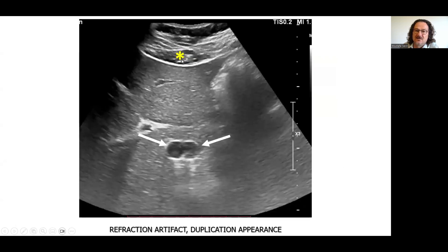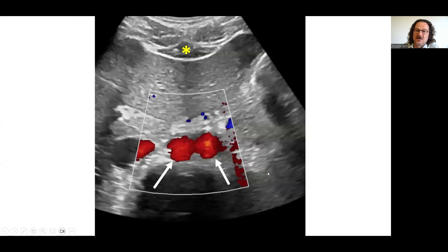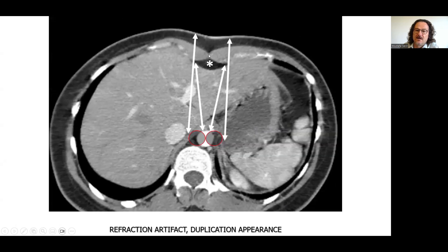Another consequence of the refraction artifact is duplication of vessels, due to this prismatic effect. The original sound waves travel normally, but the preperitoneal fat acts like a prism, refracting the sound wave so that the original aorta is seen as two aortas, incorrectly located relative to its original position.